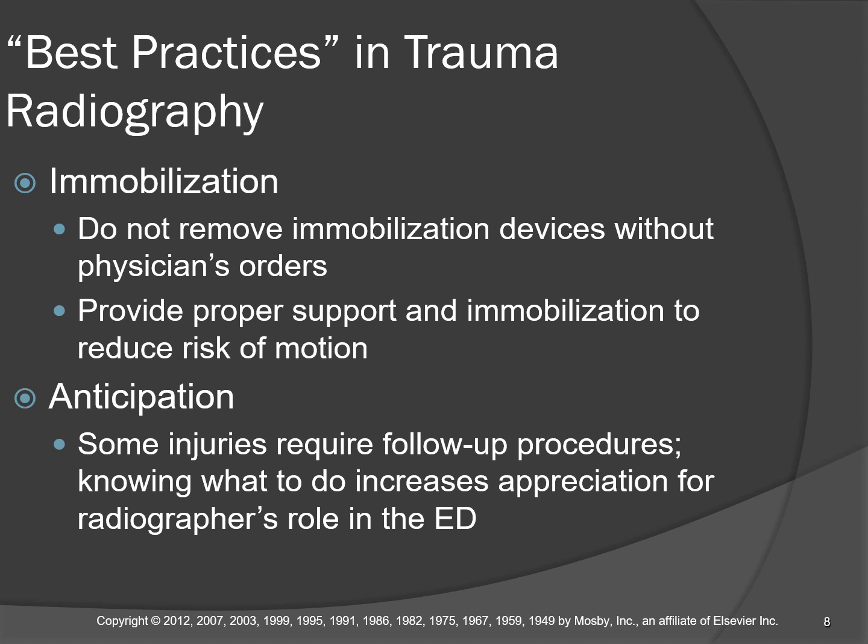Once you take the immobilizer off, it's your responsibility to not manipulate the part as much as possible, to retain the spirit of immobilization if you can. That is, keep the body part still. Remember, the only reason you're moving the immobilizer is to get rid of the metal artifact, the splint rods, if you will.